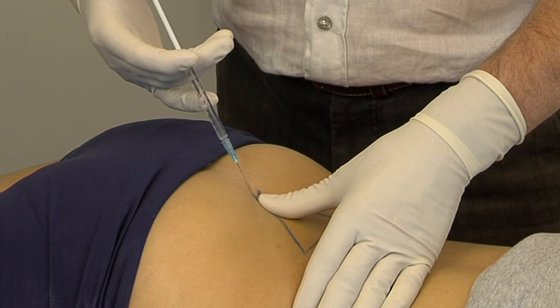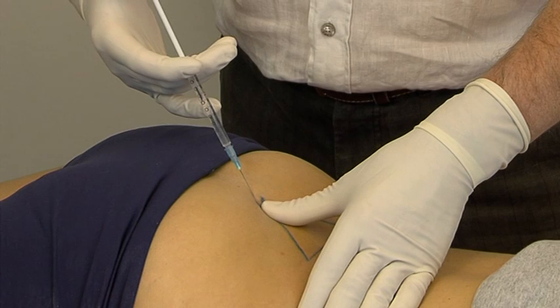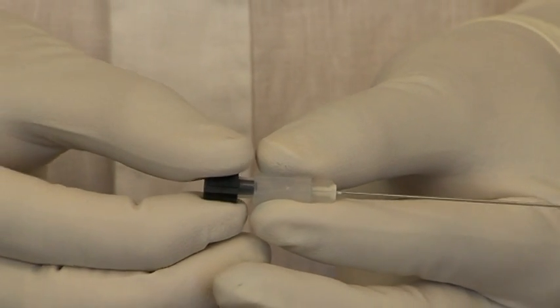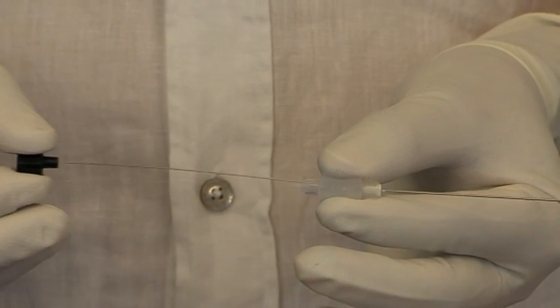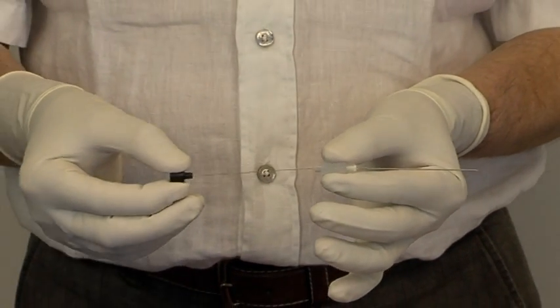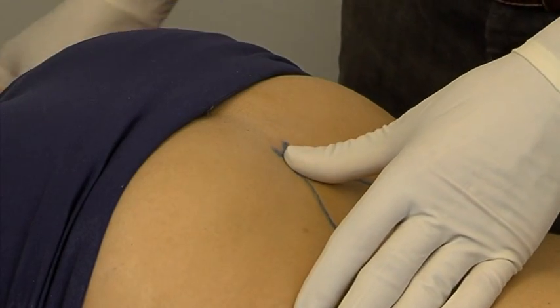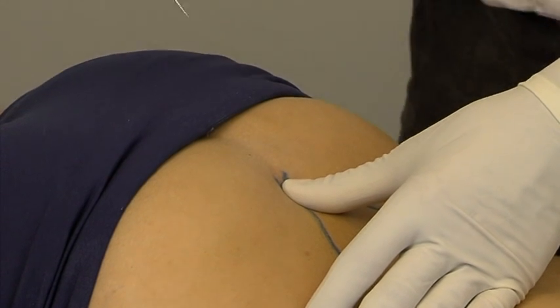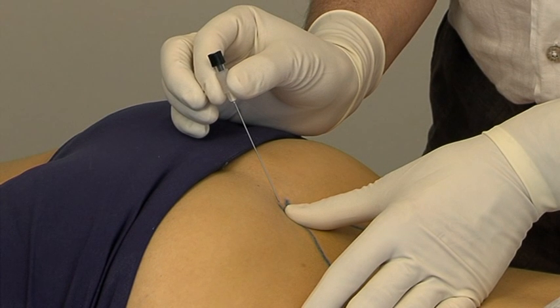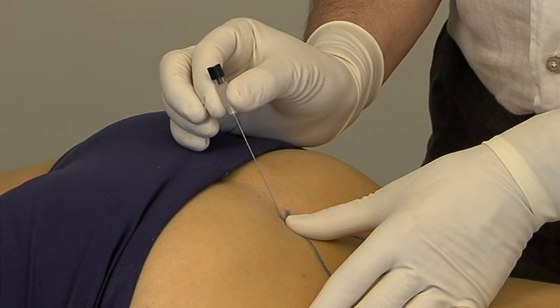Note is taken of the angle at which the little needle has to be held to penetrate the intercorneal ligament under the left thumb. The insertion is made with a lumbar puncture needle equipped with a stylet. He thrusts the needle through the spot in the skin already anesthetized, just below the hiatus and the palpating thumb, along the same track as the needle used for surface anesthesia.